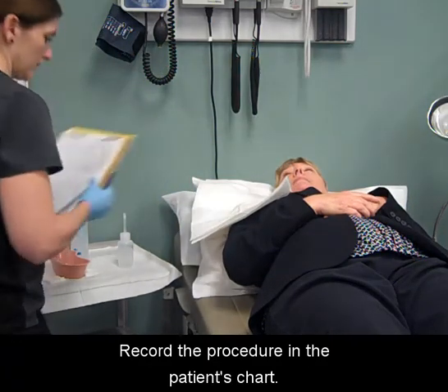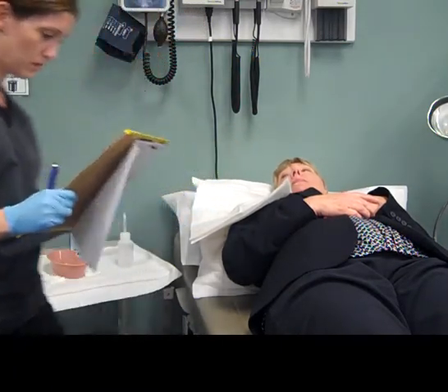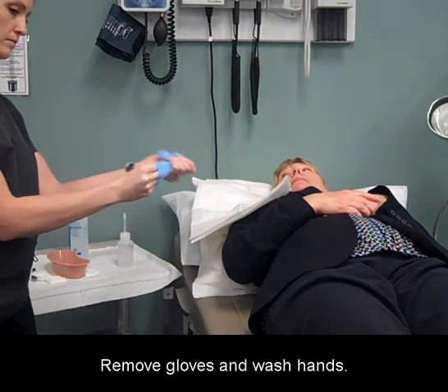Record the procedure in the patient's chart. Remove gloves and wash hands.